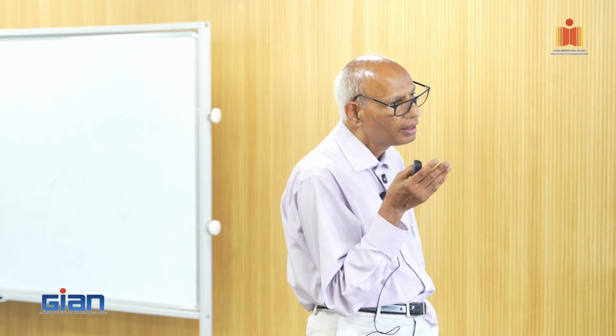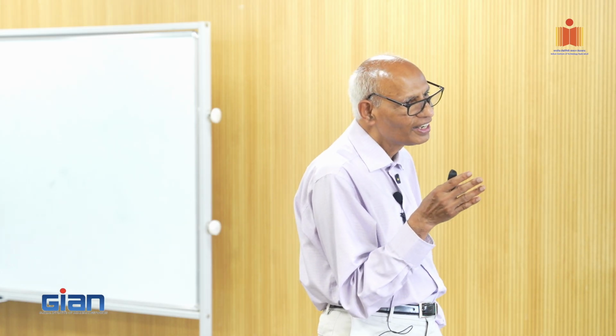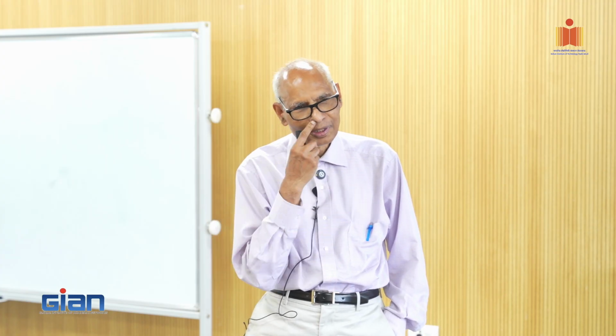So what is the benefit of proton therapy? That's a question that you have to remember. Now is the time to emphasize it. You can get the same target coverage using an X-ray machine, X-ray dose, TrueBeam, high energy X-ray. With the proton, what benefit do you get?